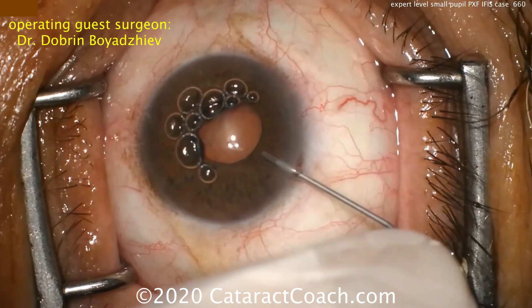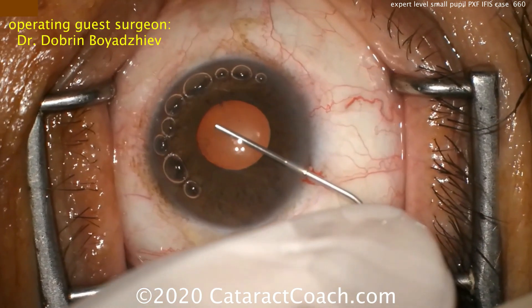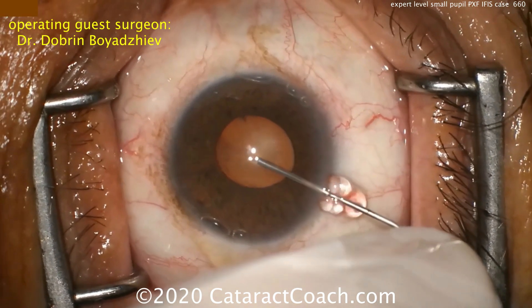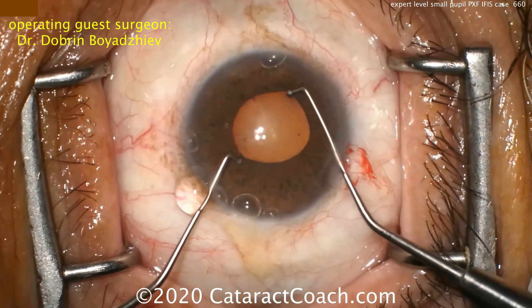Once that's done, putting in viscoelastic — as Dr. Osher taught us — viscomydriasis: expanding the pupil by injecting it right there at the pupil margin. Now we have about a four millimeter pupil.